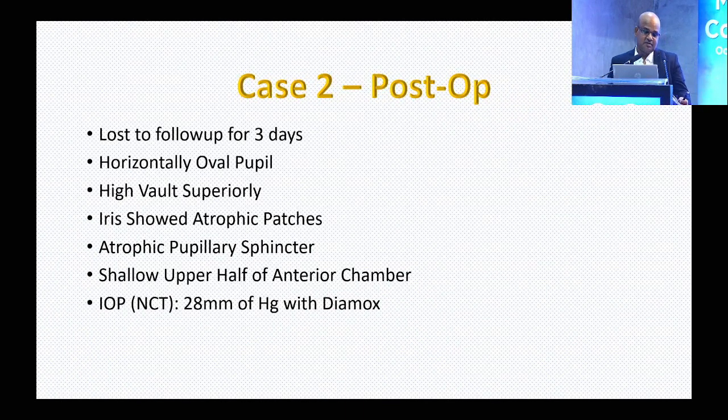The patient was lost to follow-up because of pain. Although we were calling, the patient was not picking up the phone. The pupil was horizontally oval. When we saw her after three days, we found a high vault superiorly. The iris showed some amount of atrophic patches. Even though the patient was on Diamox, the pressure was on the higher side, 28 mm of mercury.